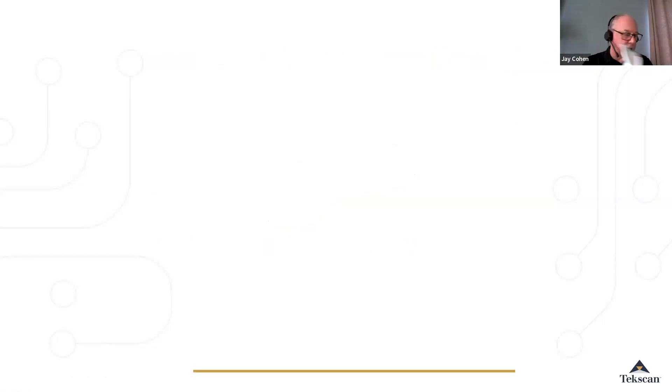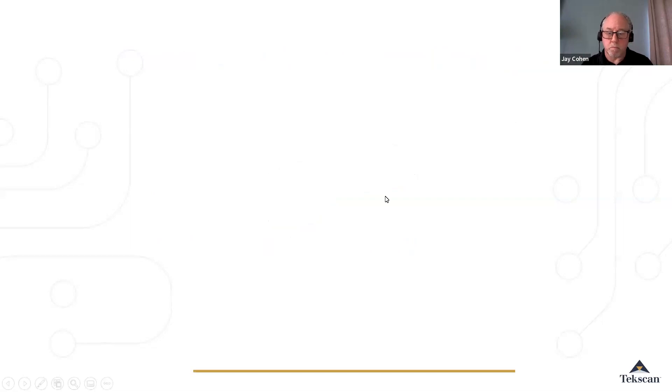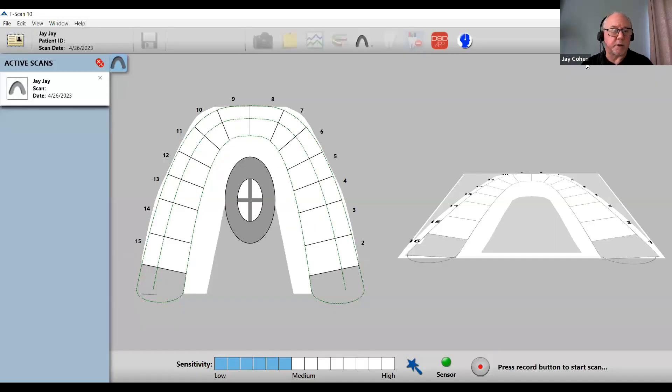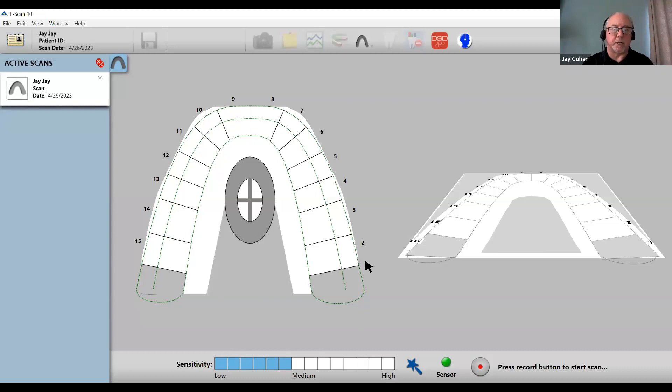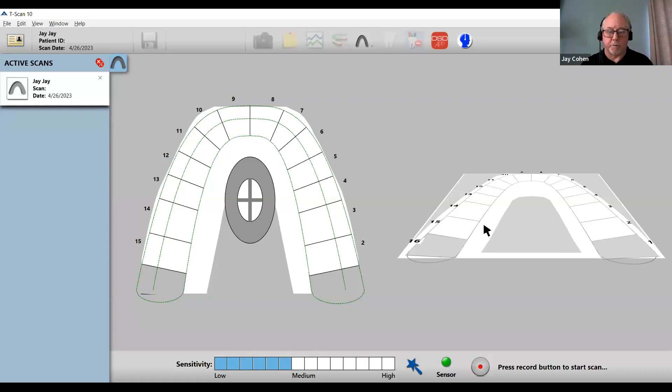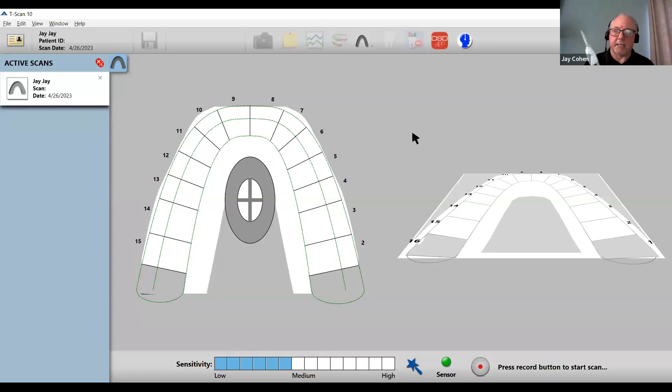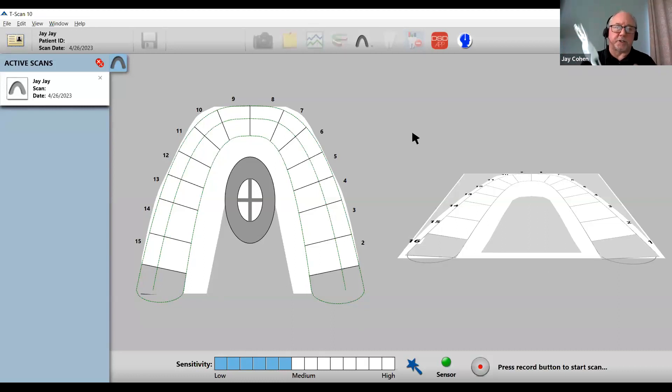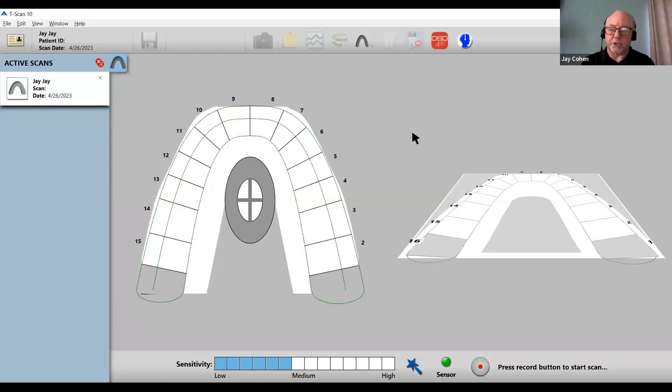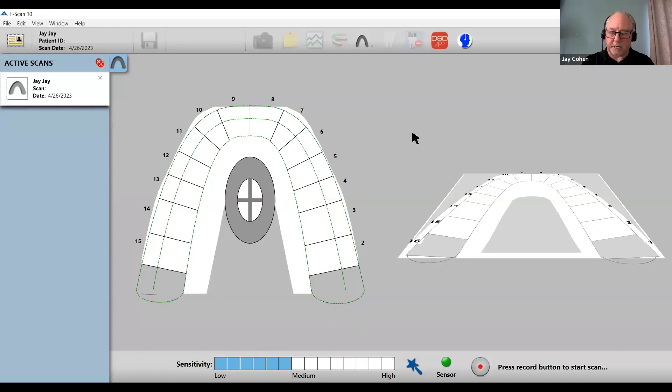Let's jump right into the T-scan software. On the left side of your screen, you see the two-dimensional arch, and to the right side, we see the 3D or columnar force view. The sensitivity sets a range of output between low and high, so that each individual patient's forces fall within that range.